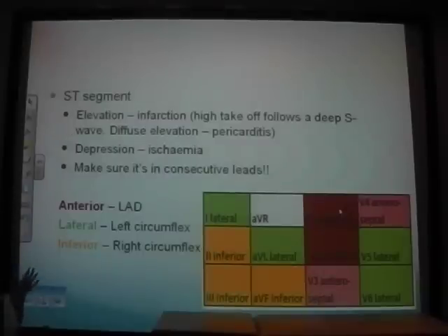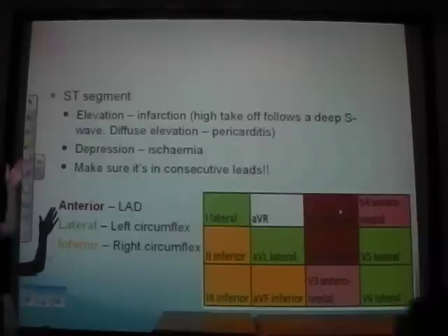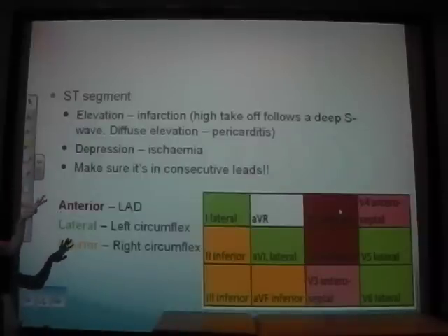Be careful with ST elevation because it can be infarction, which is the most important thing to mention and rule out. It can also be high takeoff. Sometimes you get what looks like an elevated ST segment, but it's just high takeoff, which you get after a really deep S wave. So if you go Q, R, and then a really deep S, you might have what looks like a raised ST segment, but it's high takeoff.